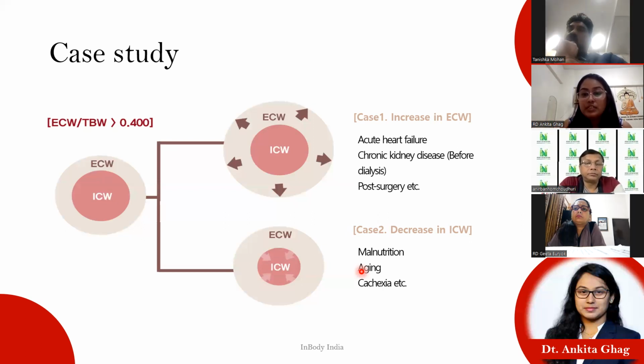So that becomes very easy just by understanding what our line of treatment will be when we figure out the difference in their edema. Is it because of the existing disorder or because of the muscle breakdown?